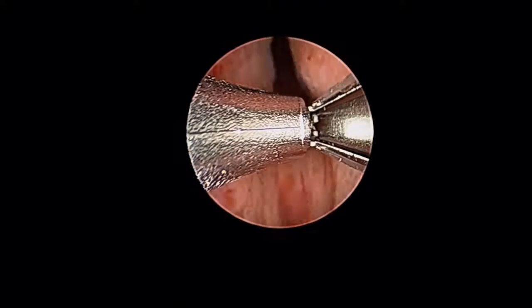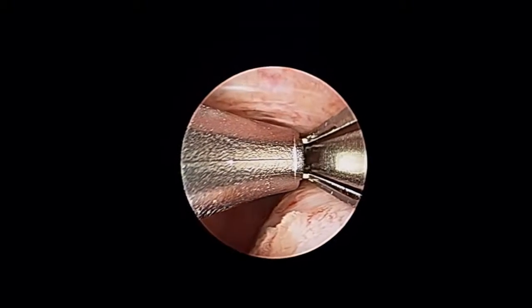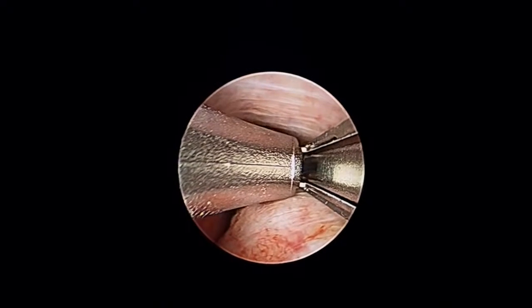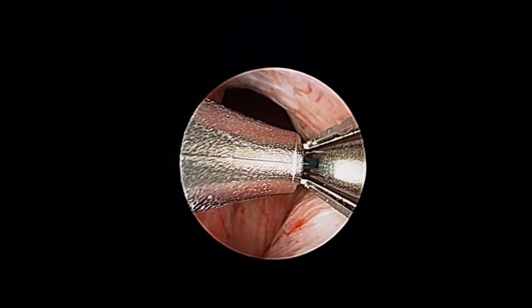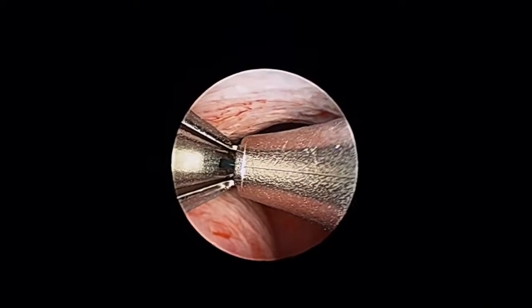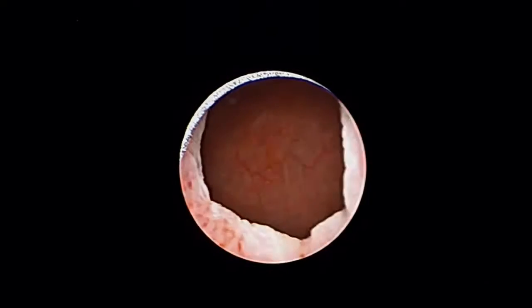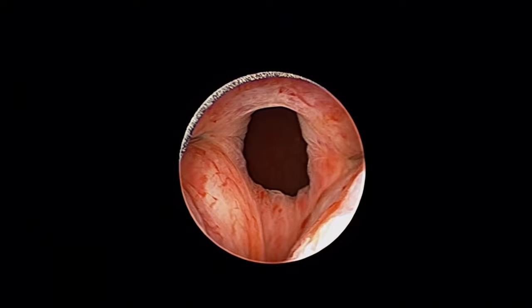Here, you see the Urolift delivery device inserted into the prostate channel. The device contains that small implant we saw earlier. I picked the right spot to maximize the tenting effect and deliver the implant. I do the same thing on the other side. Now, we pull back from the bladder into the prostate channel and see a significant opening of the prostate from the delivery of just 2 implants. You'll also notice there's no bleeding to cloud our vision.